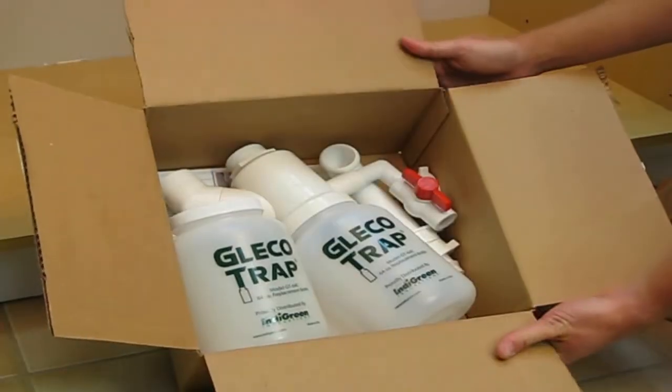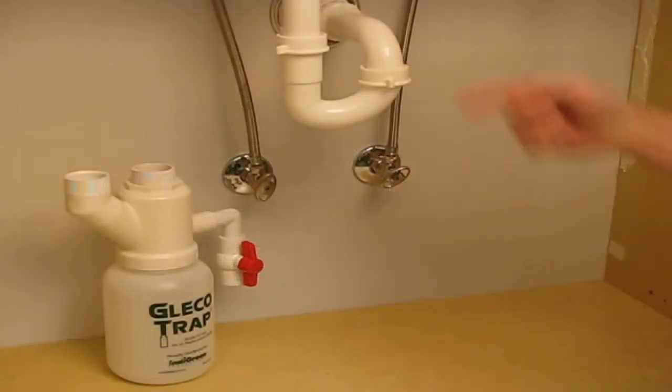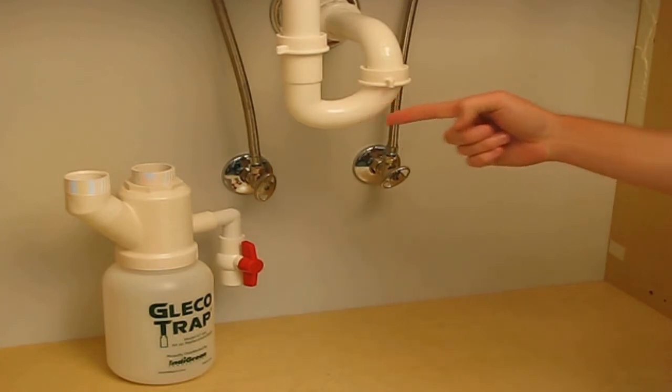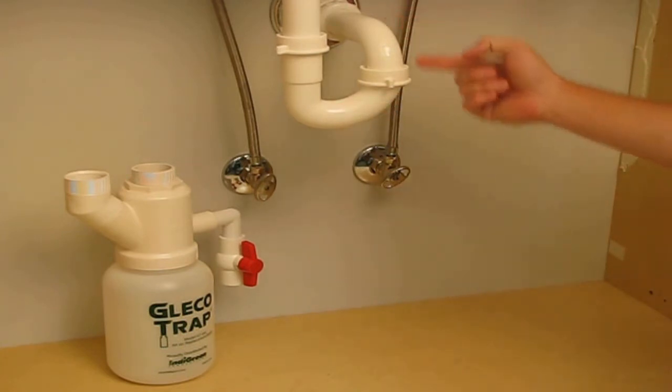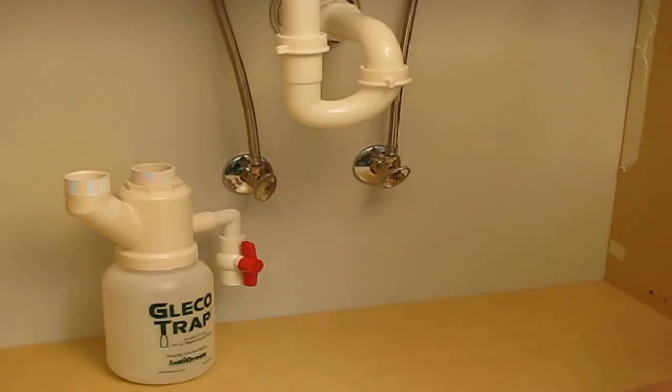A standard GT64 comes complete with everything you need to install into most standard sinks. Universal Plumbing Code approved PVC parts are used to ensure proper fit and easy installation. It's so easy, you can do it yourself with no need to call a service tech or a plumber.